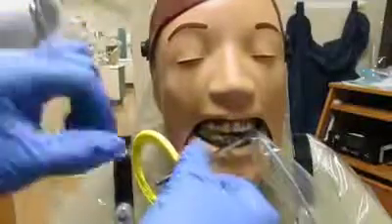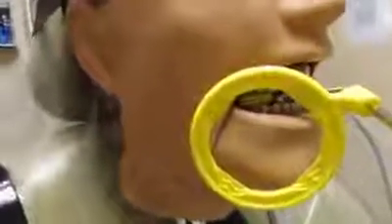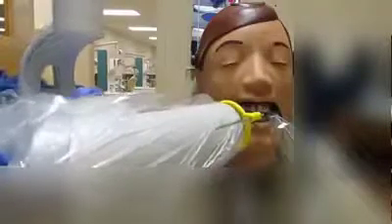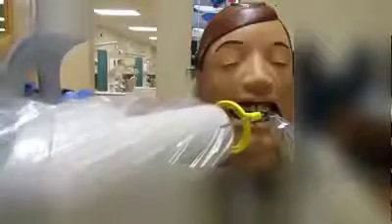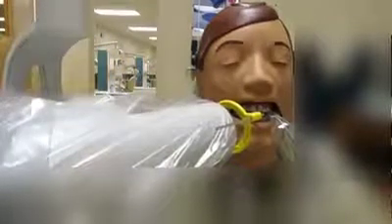The same steps must be used for the mandibular premolar exposures. Center the receptor at the first mandibular premolar and away from the teeth. Have the patient bite down on a bite block and align the PID with the ring. Notice for the mandibular exposures the PID is facing slightly upward.